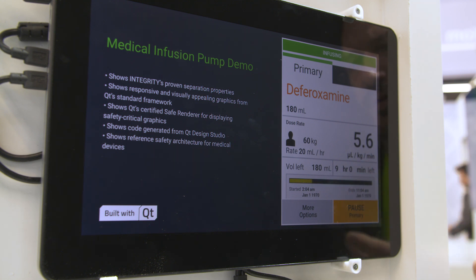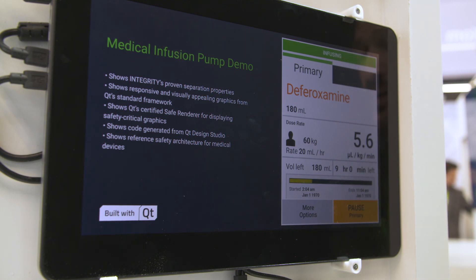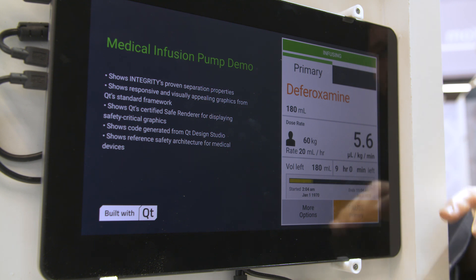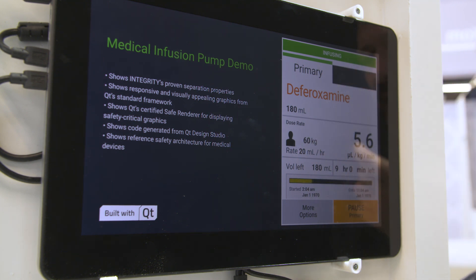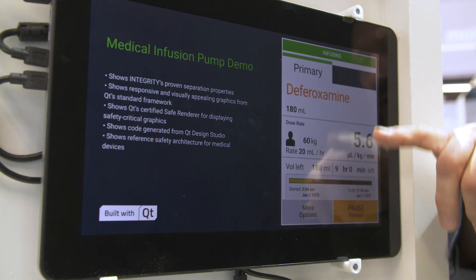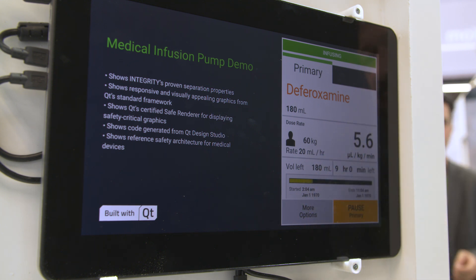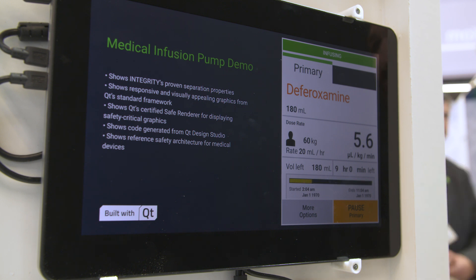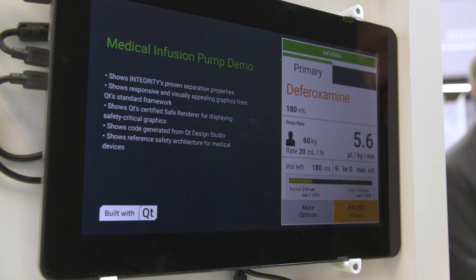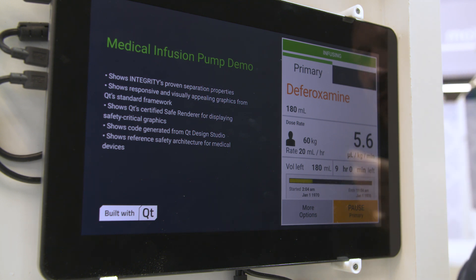This is running on the Integrity real-time operating system. The reason we chose Integrity is because of the cybersecurity around a device like this — we need to secure it from being hacked and the dose rate being changed, and we also have to secure the patient information because of patient privacy.